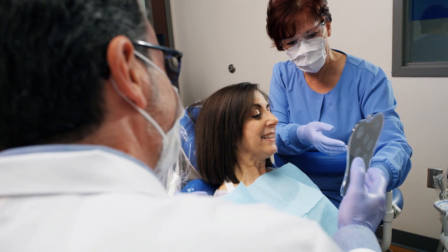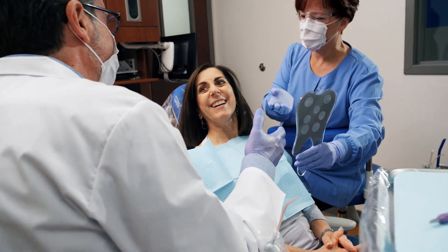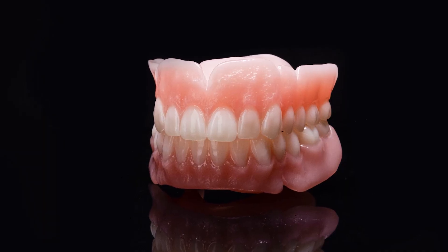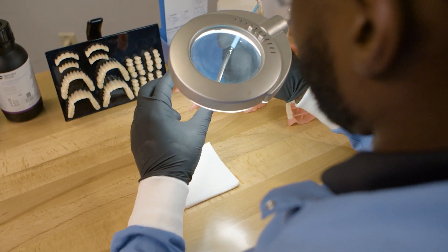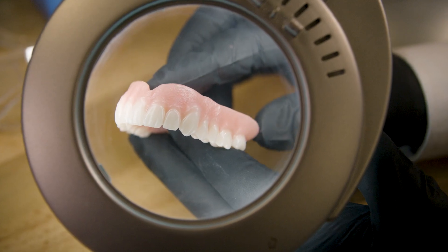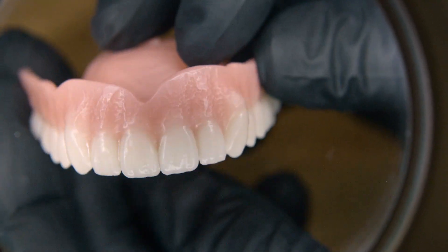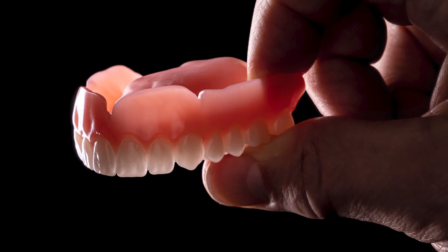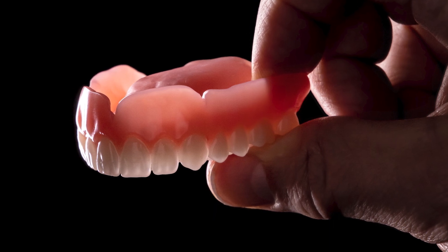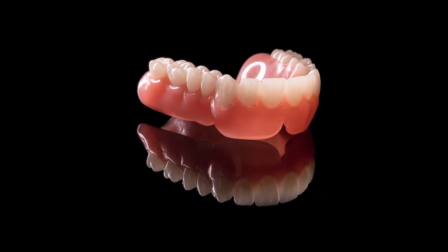It's making patients look very natural in their smiles. A premium denture tooth to Dentsply Sirona means two things: one is wear resistance, and two is aesthetics. A lot of our work was focused on achieving the same level of wear resistance that our carded teeth currently have. The front mamelons were focused on as well as the translucency of a tooth to really give it that authentic look.